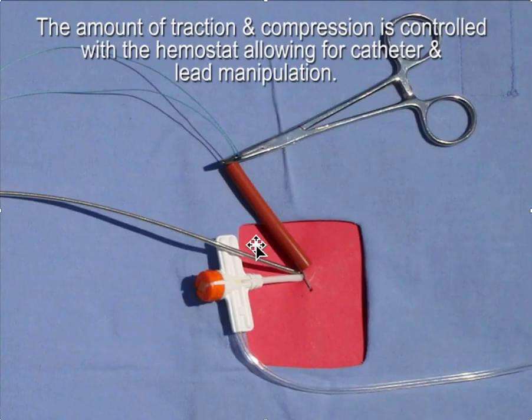This is what it would look like. We have a soft rubber tubing, and we have the suture going underneath the sheath and the lead, and we can put pressure downward on the access site as well as from below.